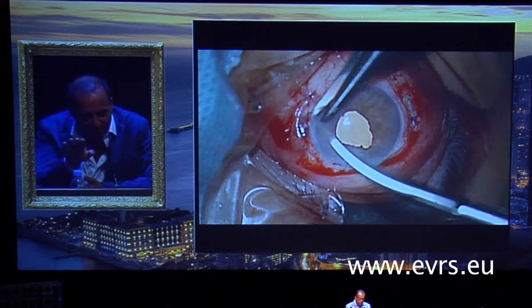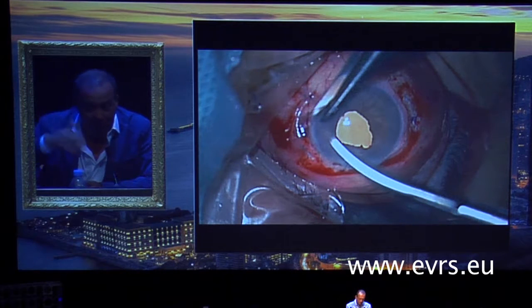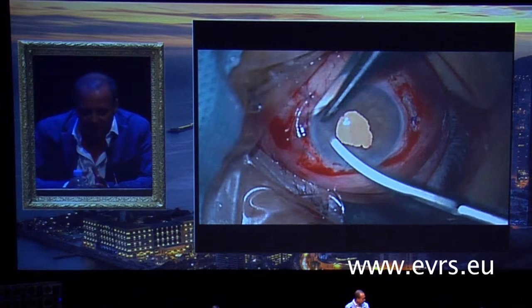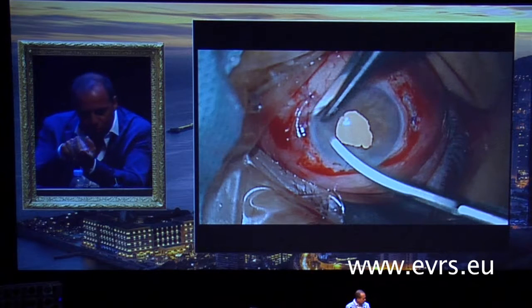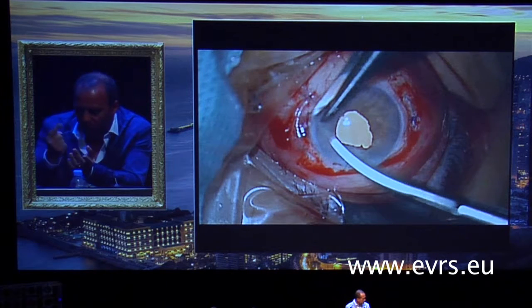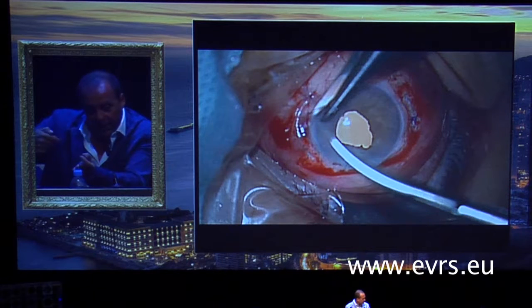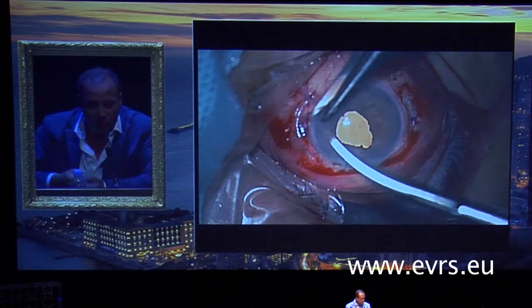It was the first and the only surgery that I performed this way, last month. And so now I will do it again and again, and I want to do it a little bit better, because once I want to try to put the IOL with the injector, so put the tube on only one haptic, inject the IOL without opening the whole cornea, and put the tube on the other haptic afterwards, and then pull it. That's great.